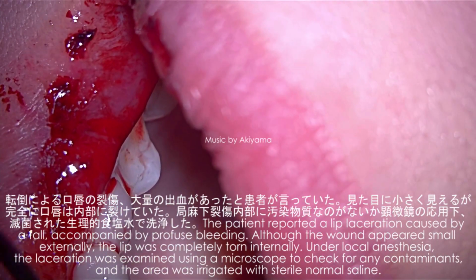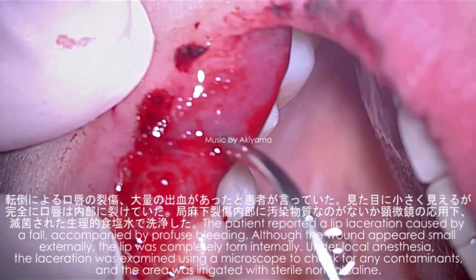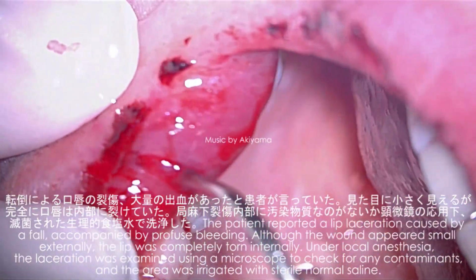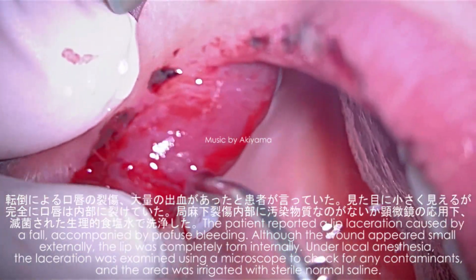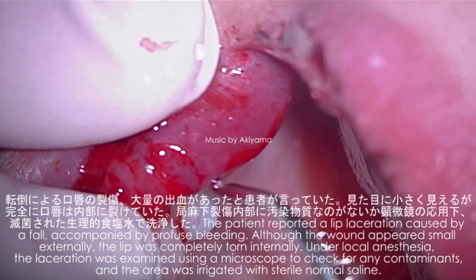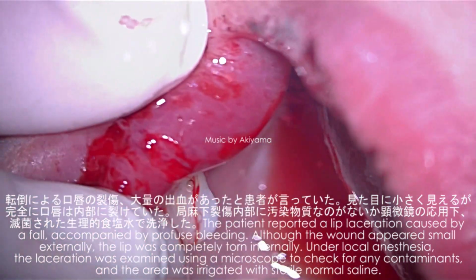The patient reported a lip laceration caused by a fall, accompanied by profuse bleeding. Although the wound appeared small externally, the lip was completely torn internally. Under local anesthesia, the laceration was examined using a microscope to check for any contaminants, and the area was irrigated with sterile normal saline.